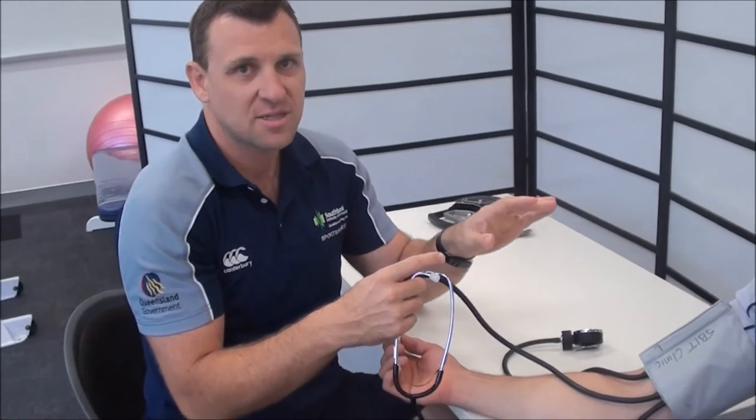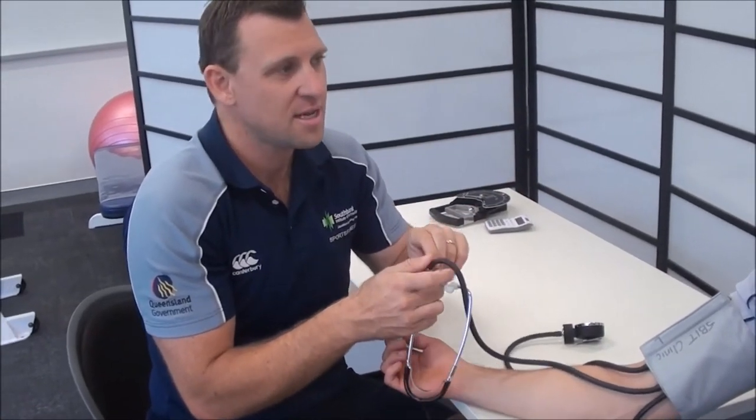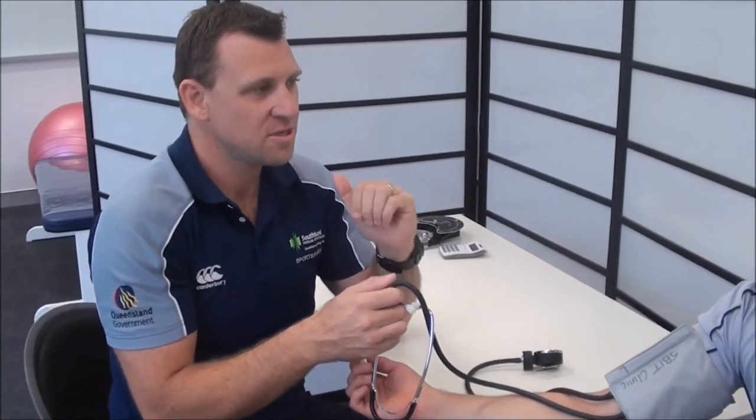I'm listening for the first tapping sounds that I hear — that's systolic blood pressure. I'm going to continue to drop the pressure until I can't hear any sounds. Where it goes from tapping to nothing, that is our diastolic blood pressure.